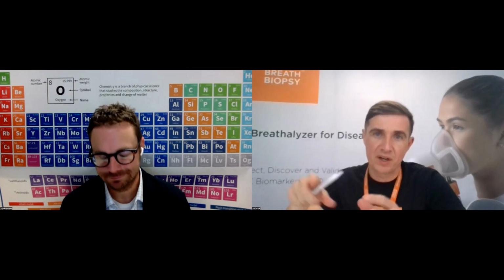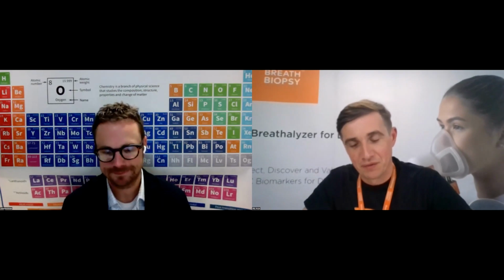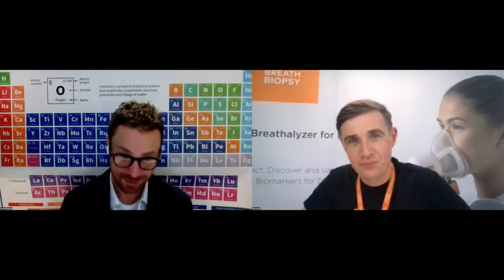Great. And it sounds then, so, with the TD tubes themselves, we have 4 tubes, and we've tried to pressure match tubes as well to try and deal with the issue of variability of flow. But it sounds like the overall conclusion is it doesn't have that much of an impact. Is that a kind of fair conclusion? So based on the results I have, that is the conclusion.